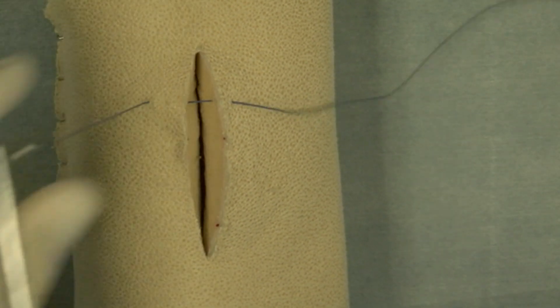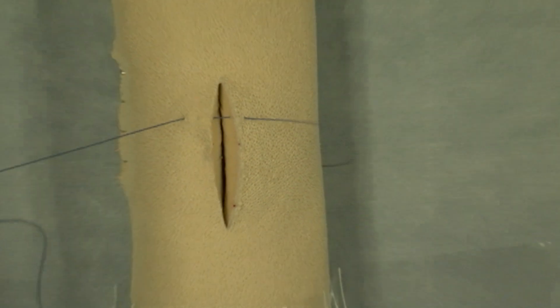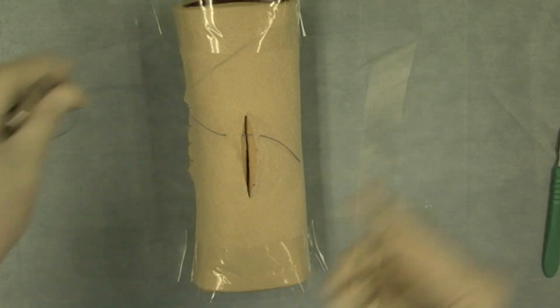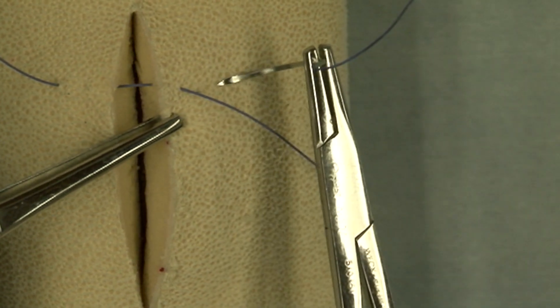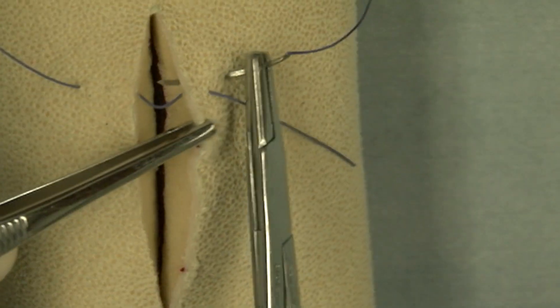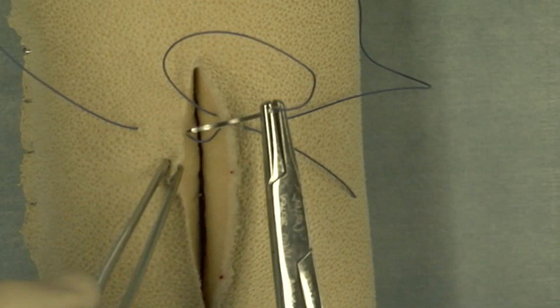Reset. I'm going to pull through the suture material so I don't waste a lot of suture. Now this third bite is far from the edge and the fourth bite is near the edge.